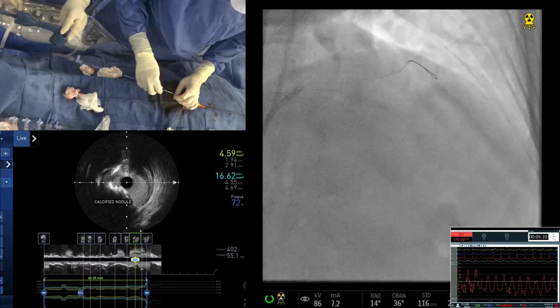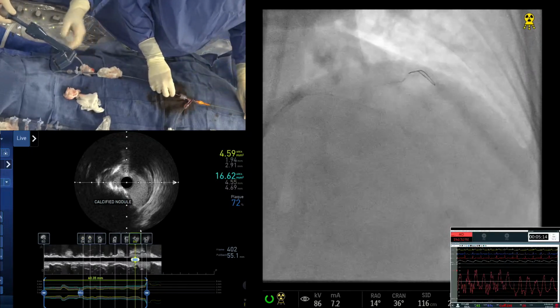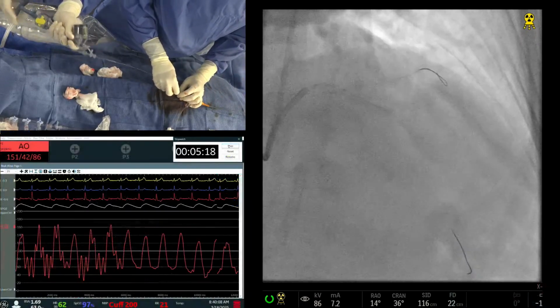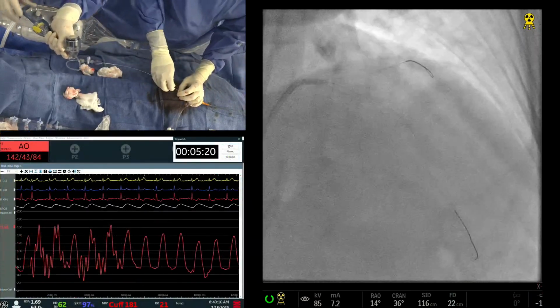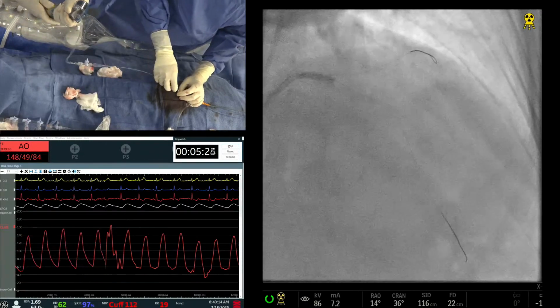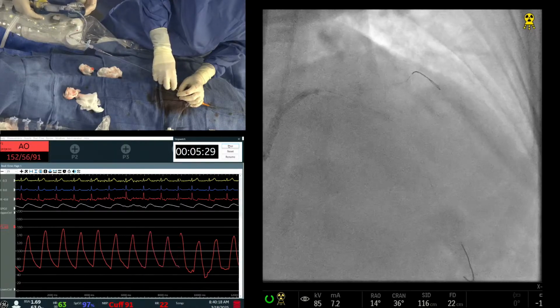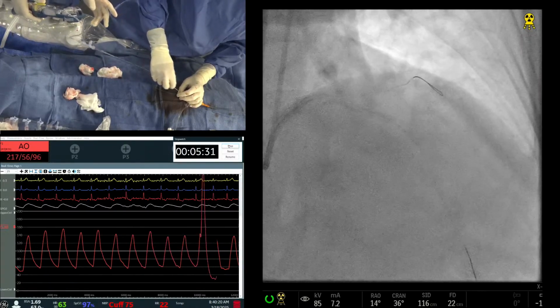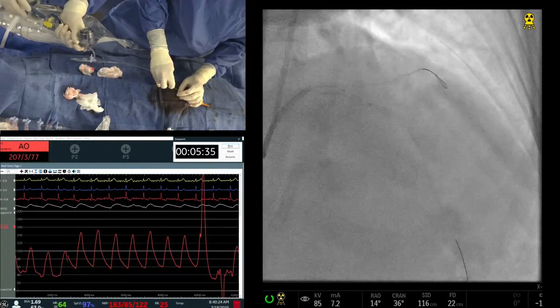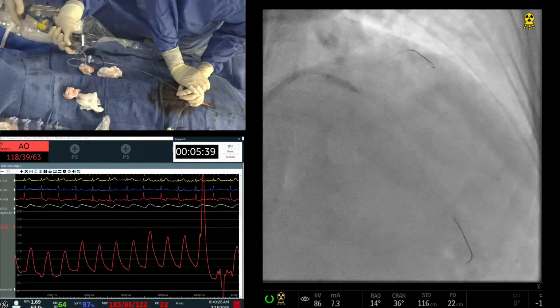Okay, let's go up here first. Anu, go ahead. I was just thinking, double wire. We should not remove the double wire now. So the question was, could it be a crisscross of the diagonal and LAD wire? That's one. Secondly, it was just such a tight lesion. No, it was not a tight lesion. If you see the IVUS, it was just the wire bias.